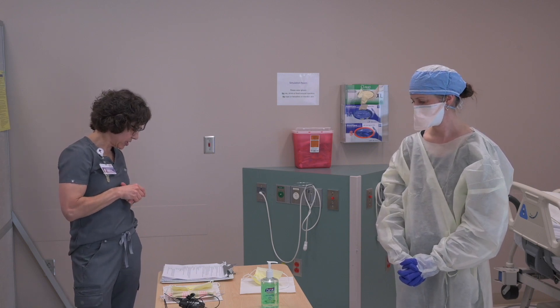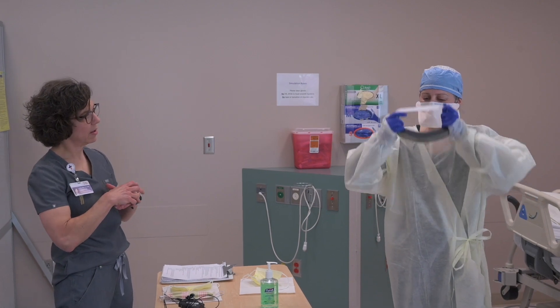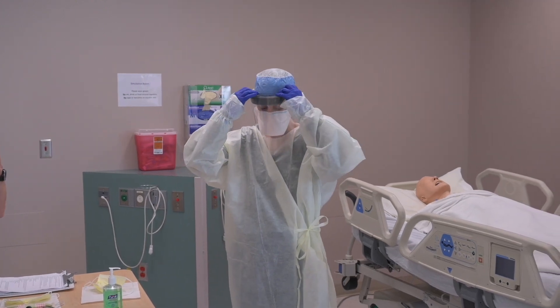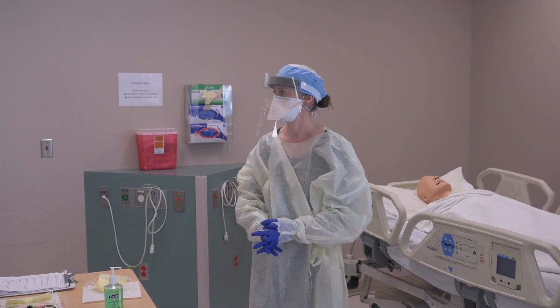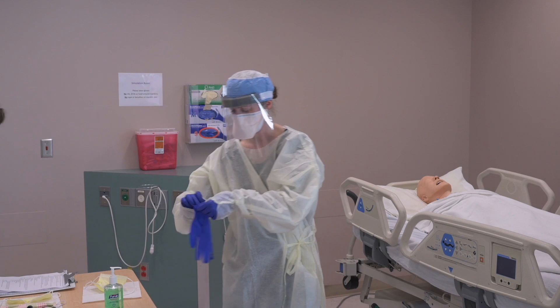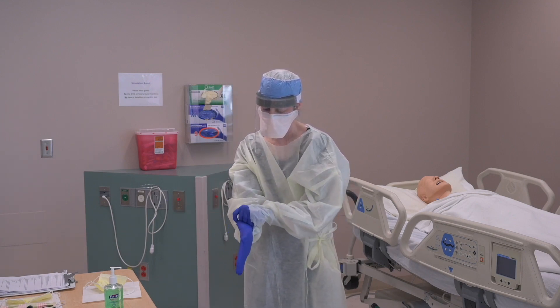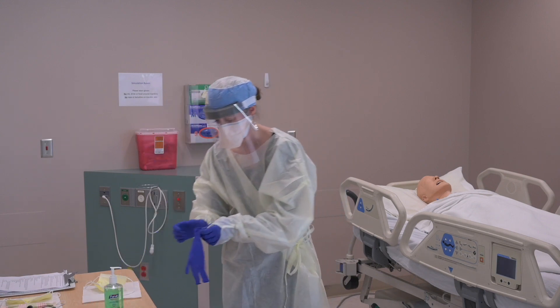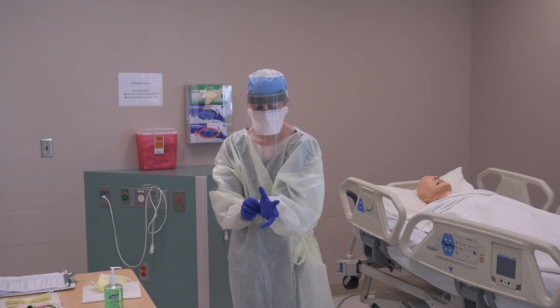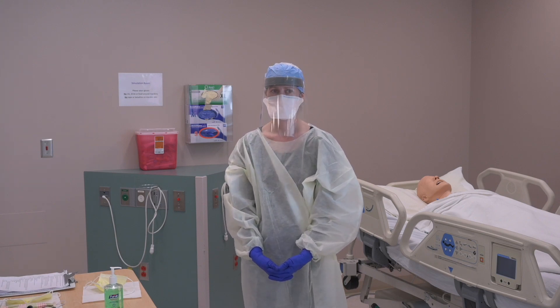Brooke, next you're going to put on your face shield. That face shield extends over and provides protection of her mucous membranes and her eyes, and covers that mask. Next you're going to put on your second pair of gloves. That's our PPE ensemble — she would now be ready to go into the patient room.